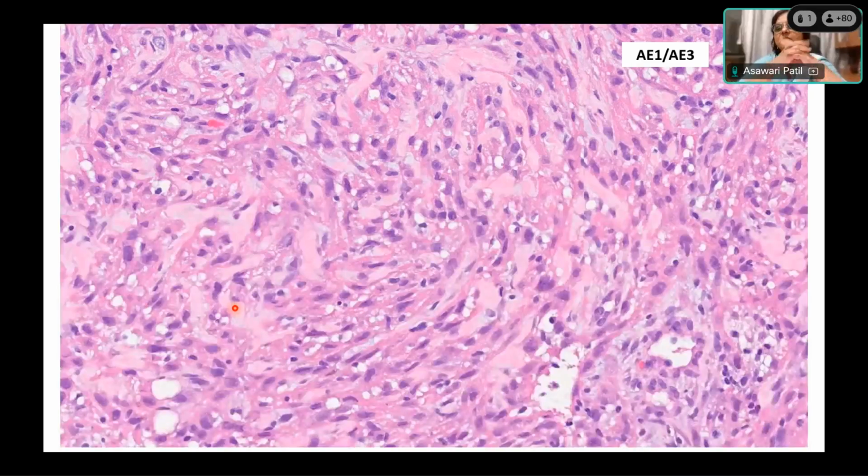Now tell me, who wants to comment on this? You get a biopsy like this and this kind of cells are there. What is your differential? This wasn't included, but I want you to quickly comment on this. What type of tumor do you want to say? Spindle cell neoplasm. Spindle cells are there, no? Yes, initially correct, it is a spindle cell neoplasm. Now, what about the nuclei? How do you find these nuclei? Are they normal, benign looking, or atypical? Not benign looking, pleomorphic.